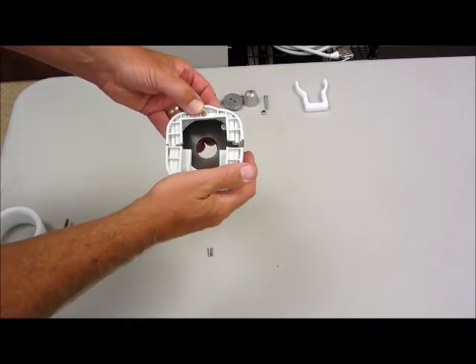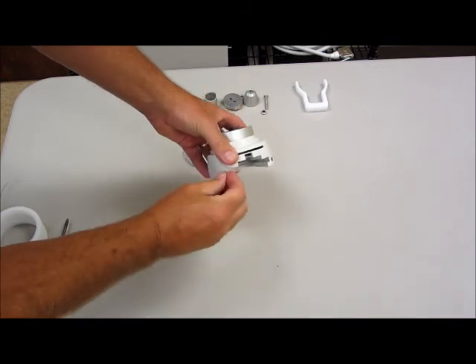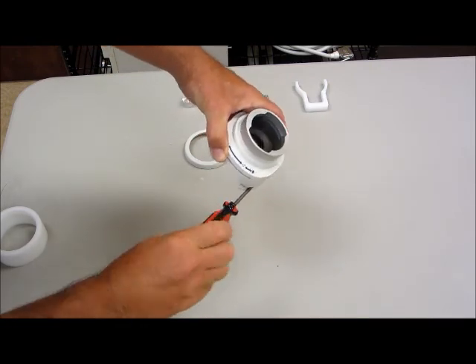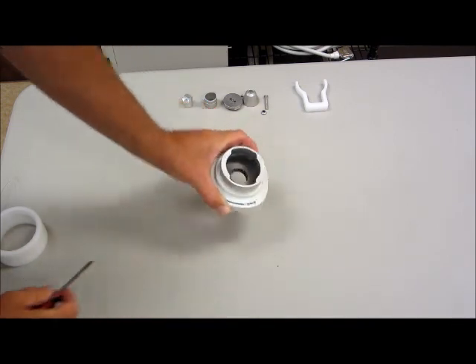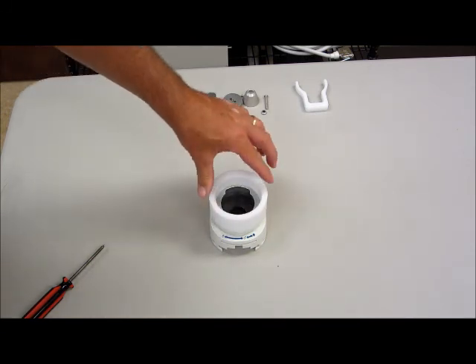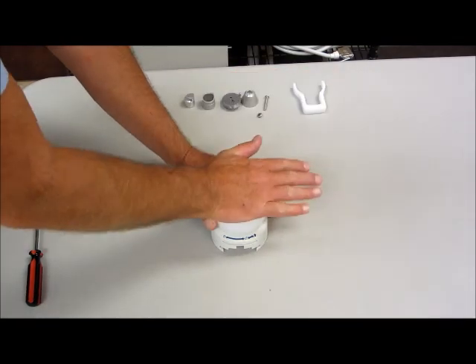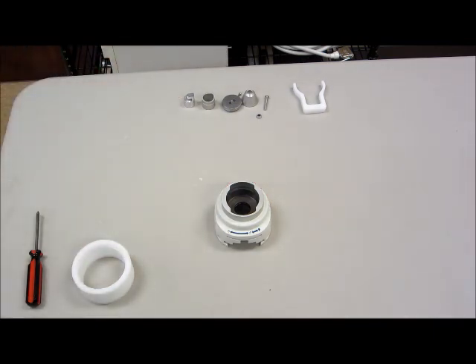Then you simply take the other half of the faceplate and slide it together. You will reuse the screws that hold the two faceplate halves together and tighten those up. Once that's done, you'll want to put the trim ring back on. It's a snap ring, so you simply pop it on so that it's fully seated. Now we have the KOUR adapter body installed into the faceplate.